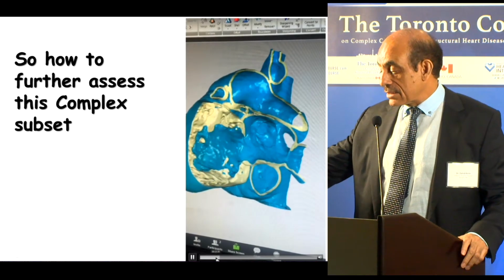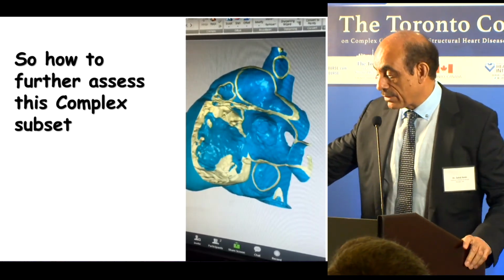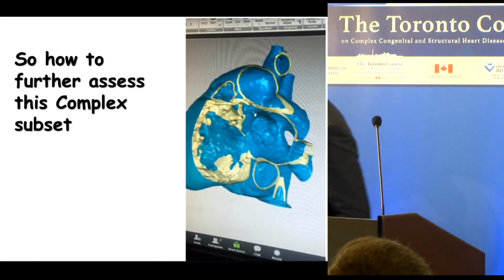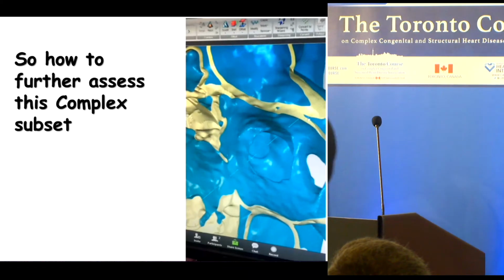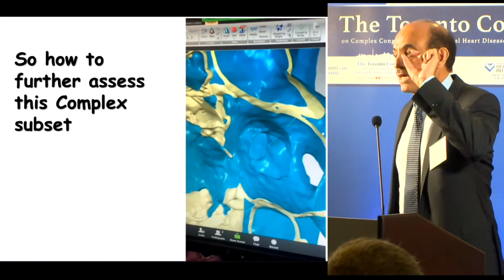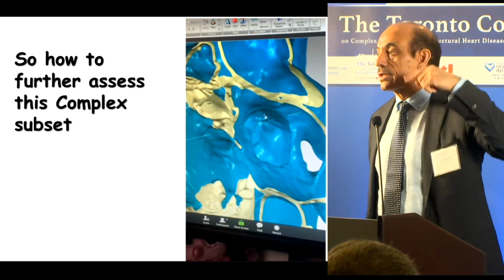If you look at this, this is what somebody called a spiral septum. This is what a spiral septum is. If you look inside the ASD here, it's like this. So there are 2 rims above, and that keeps a gap in between. And the blue flow that you are seeing is the blood swirling in that area.